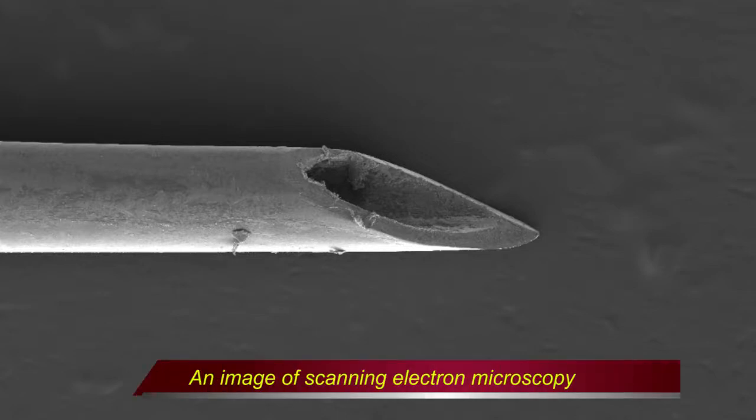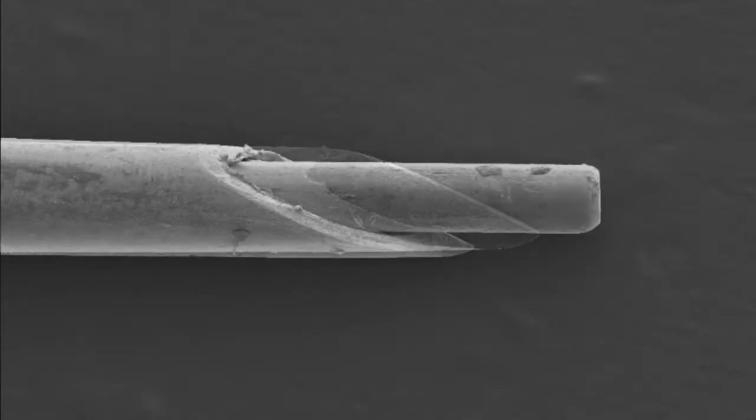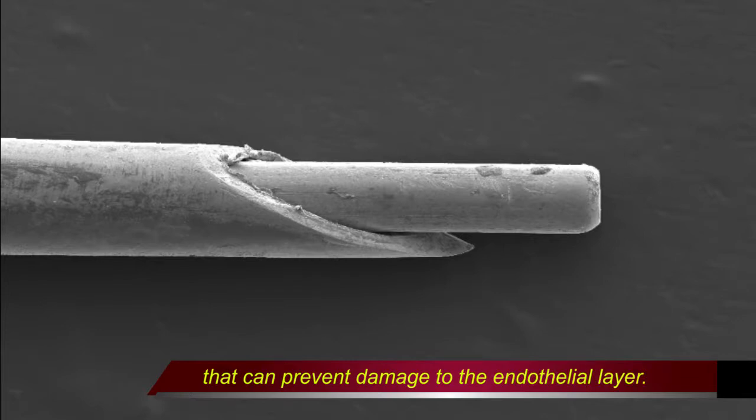This is an image of the tip of the needle as observed by scanning electron microscopy. The angle of the cutting plane of the needle from the axis is 30 degrees, and the tip is sharp enough to pierce the vessel wall. The internal wire has a smooth surface with a dull edge that prevents damage to the endothelial layer of the vessel wall.